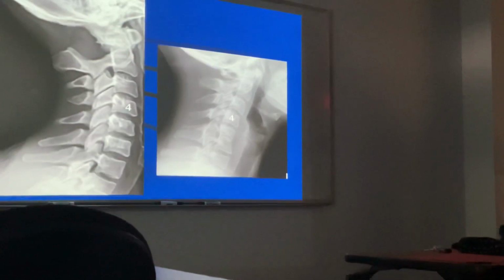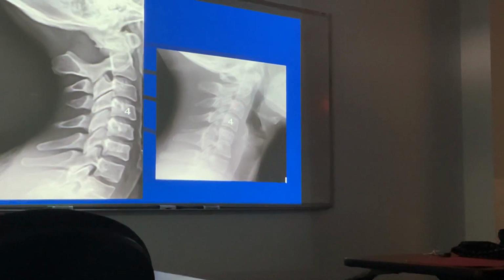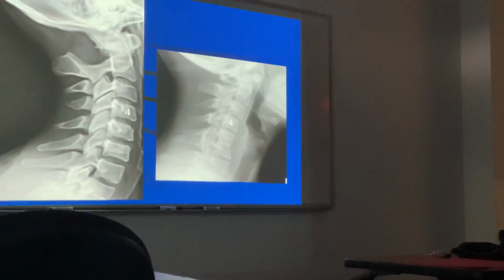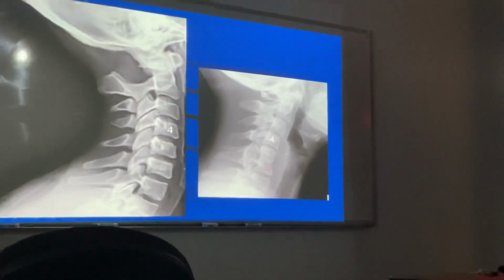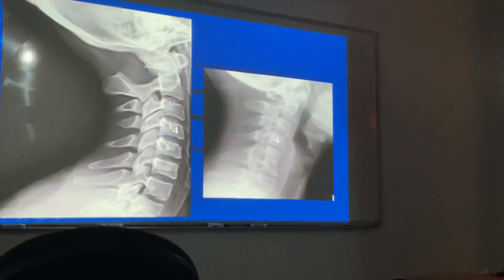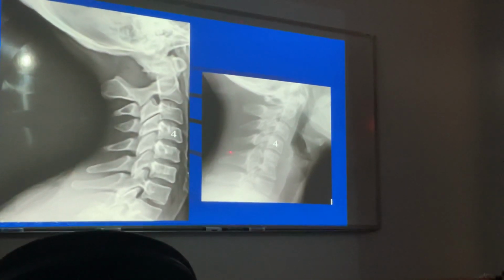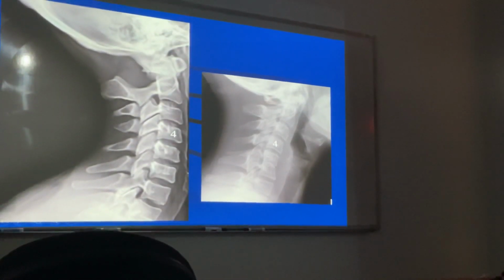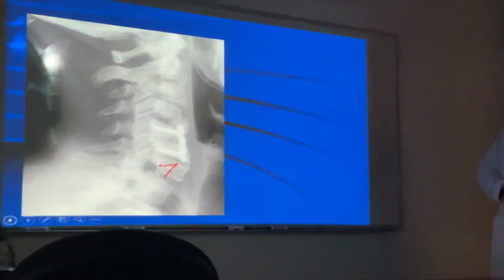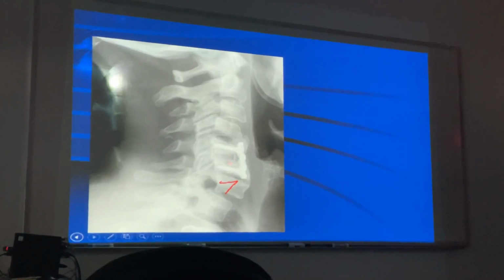This one? The vertebral bodies are together. Okay, so if you're not seeing it, you need to take a look at it and say, okay, why is C4, that's a normal rectangle, this one is not normal. That's the observation. How you get there, we'll talk about when we do our search pattern. So this motor unit 5-6 is different than 3-4, yes? Okay, and the application is, look at this interspinous space. This one is different. So that's why, when we talk about the flexion extension view today, that will help us, all right? And then last but not least, what's happened to this patient?